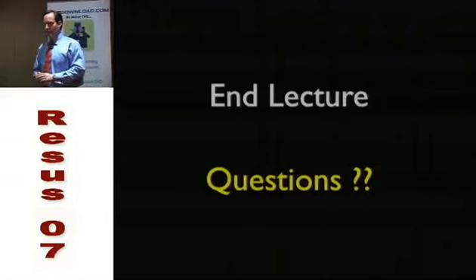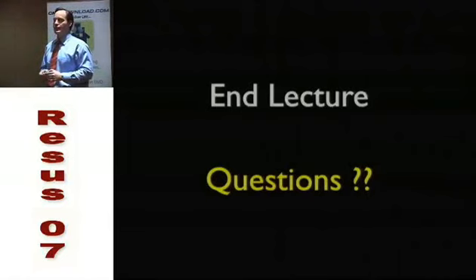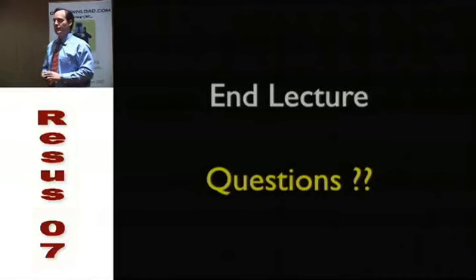Establish the ultrasound as standard of care. I think that what we're seeing now is a paradigm shift as more residents get trained in ultrasound, that it's becoming more of the routine use of care. I don't think it's to the point now that if you didn't use it for a gallbladder or an aorta, you would get sued. That may happen in the future as more and more people get trained with it.